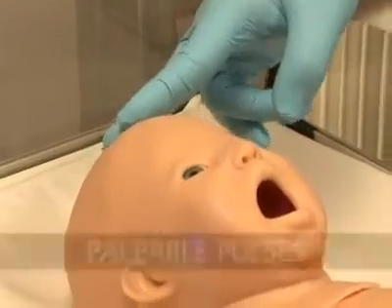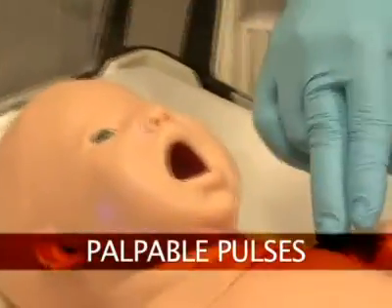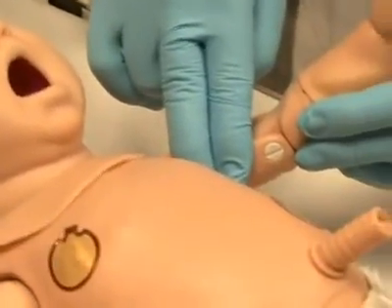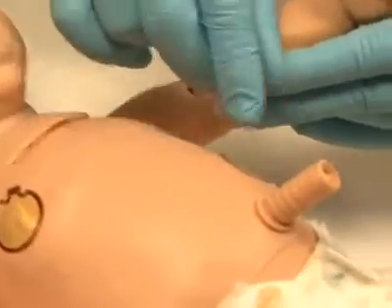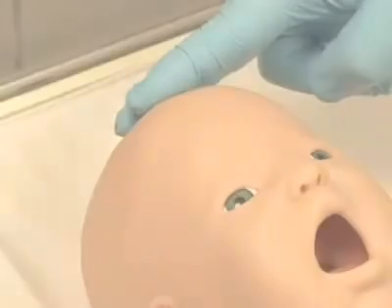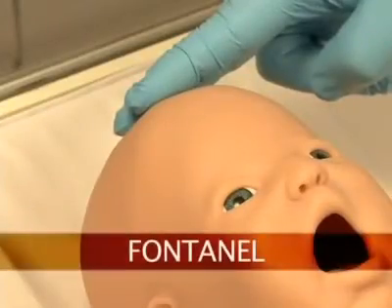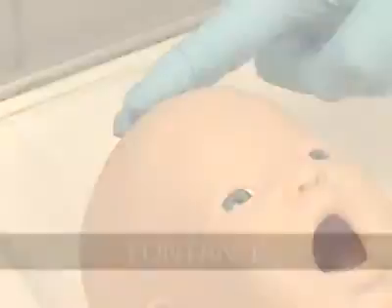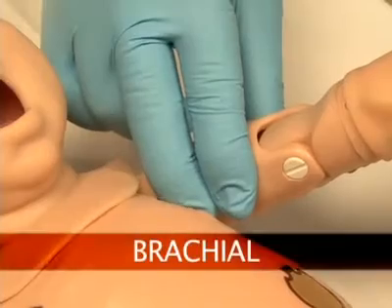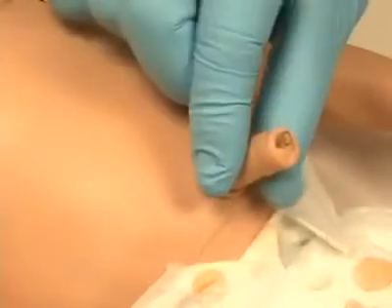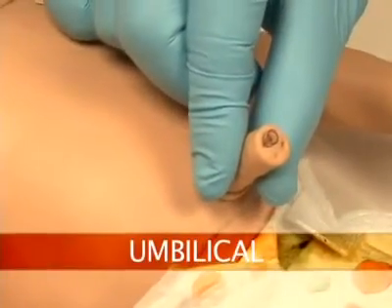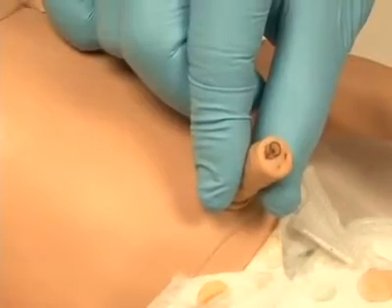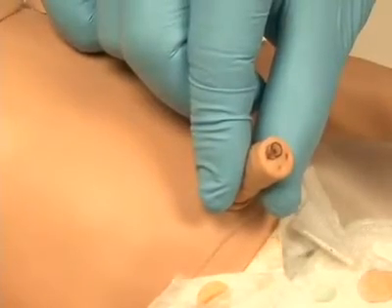Newborn HAL's palpable pulses are dependent on blood pressure. The following pulses are available: fontanelle, brachial, and umbilical. Users can also disable distal pulses.